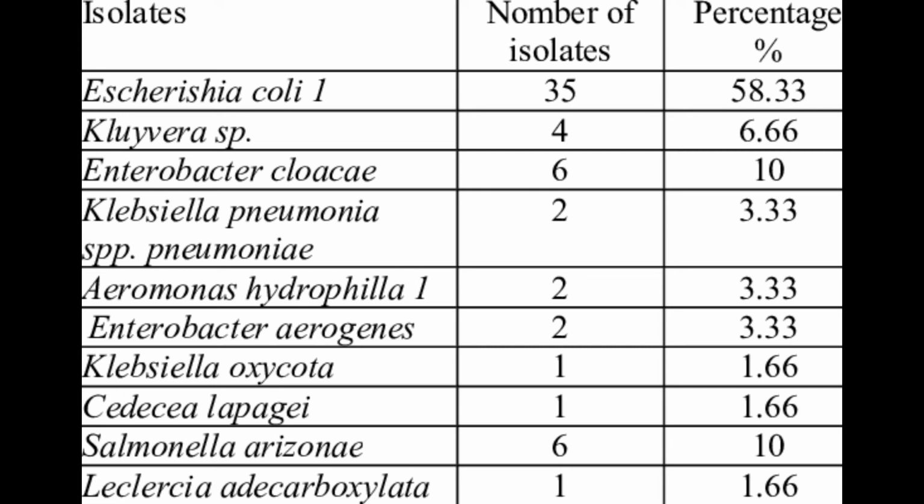The ONPG test, or ortho-nitrophenyl beta-D-galactopyranoside, determines lactose fermentation, especially in late lactose fermenters. It detects the enzyme beta galactosidase, the substrate being ONPG, and the expected result is yellow coloration within 4 hours of incubation.